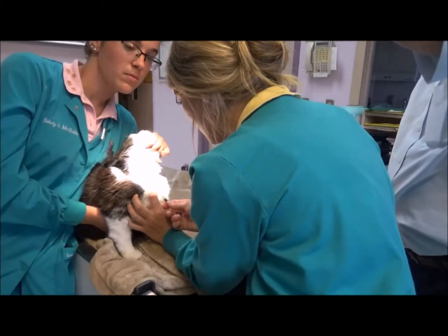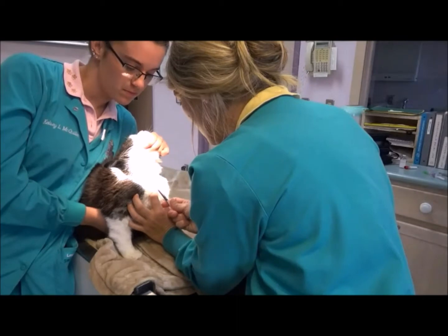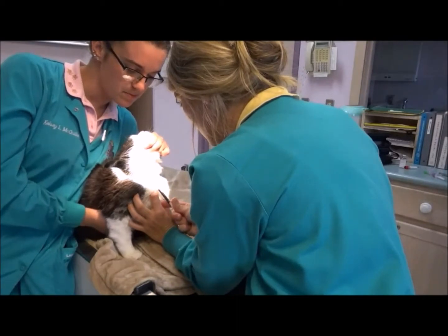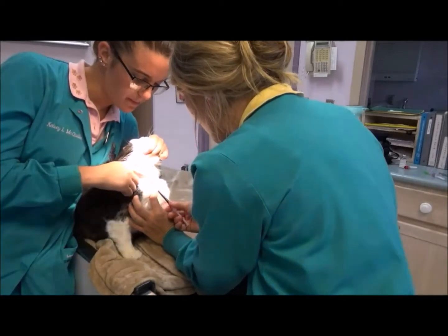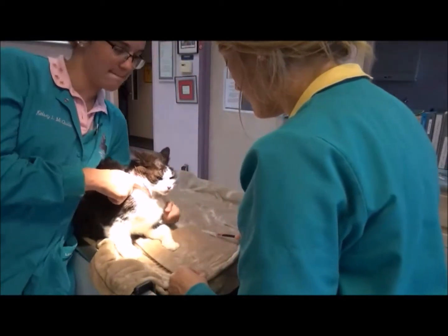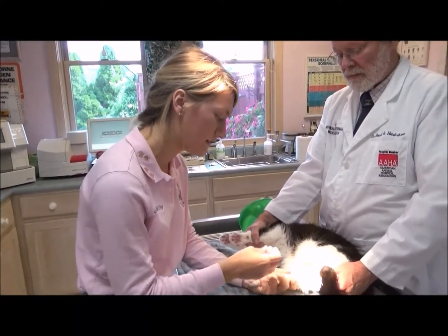Don't get too shallow. There you go. Okay, that's plenty, so I'll also put your finger. Okay, all done. Now I'm going to get a blood sample from the medial saphenous vein of a cat.